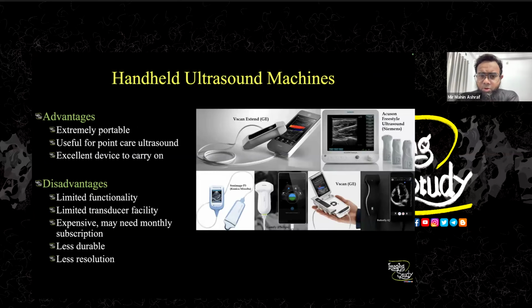These are getting very popular, and we can see the manufacturers are researching on these machines quite a lot. You see many advertisements are related to handheld ultrasound machines nowadays in different programs, different conferences. So they're more focusing on this type of machines. They have actually very big customers for this type of machines, but they have some limitations also. So let's talk about that.